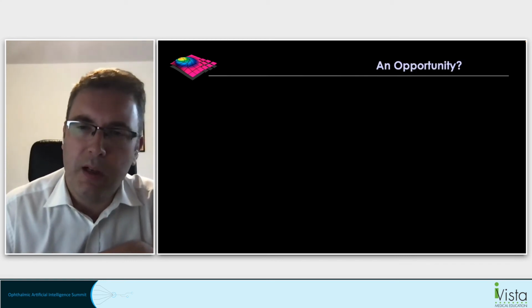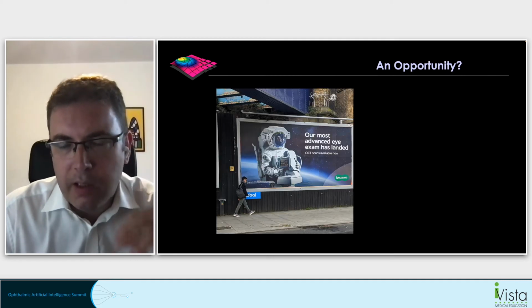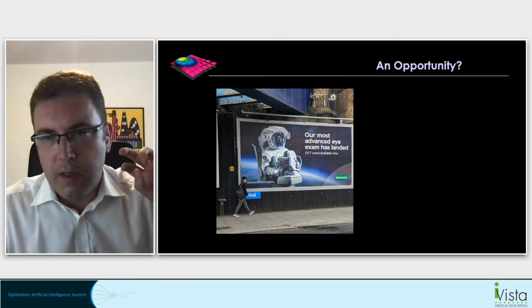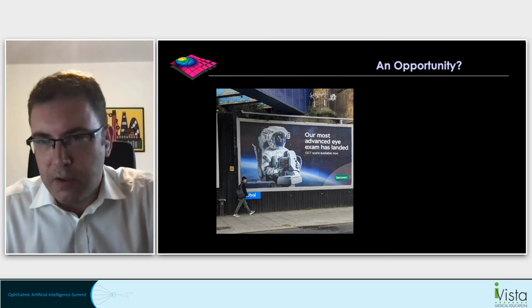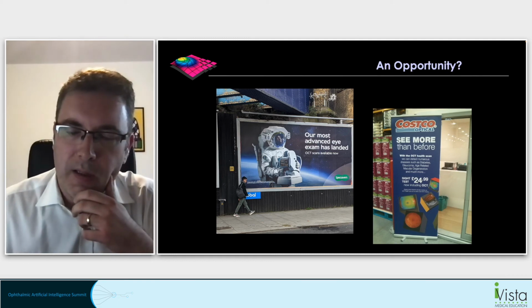And we think that there's a real opportunity here, not just for doing better segmentation of fluid, but actually bringing world-class expertise out of specialized centers into the community and into the homes of patients in the future. And so in the UK now, most optometrists in local communities have OCT scans. So the biggest chains like Specsavers, Vision Express, Costco, etc., do OCT scans as part of the routine examination.